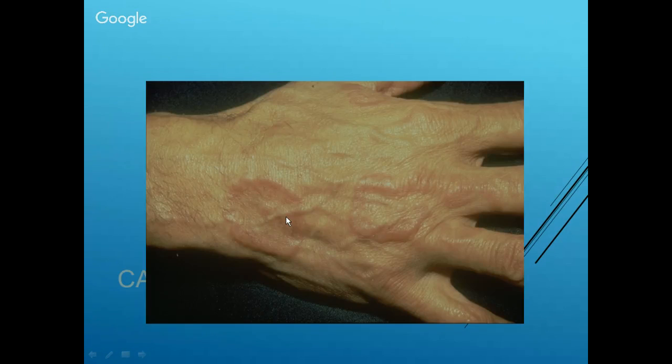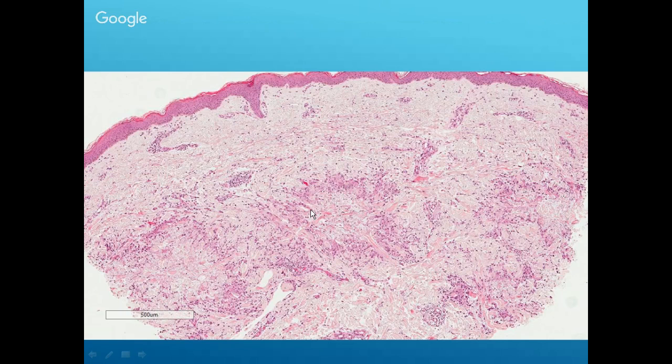Sorry. So this is the next reaction pattern, where this is present as an annular lesion. Very classically, this will come in as rule out granuloma annulare. So what do we see here? You see inflammation that is forming a circle around this collagen material, and this circle is typically called a palisade. What does a palisade mean? A palisade is a fence. So this is like a fence that is forming around this collagen material. This is known as a palisaded granuloma.